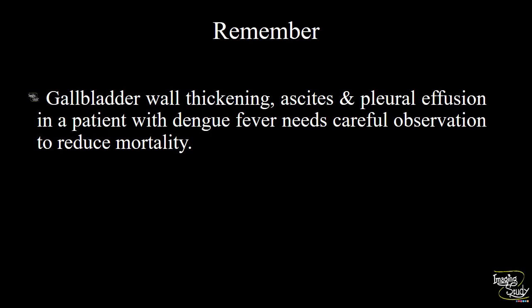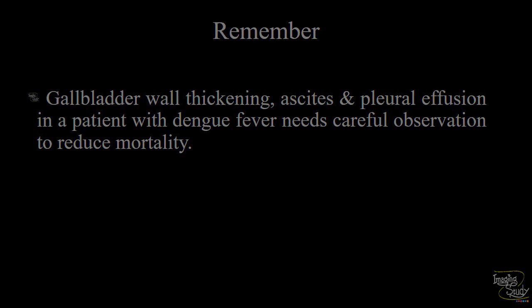The take-home message for this case: if you see gallbladder wall thickening, ascites, and pleural effusion in a patient with dengue fever, careful observation is required. We usually want to keep this patient in a center with an intensive care unit facility, because the patient may deteriorate at any time due to hemorrhagic complications or very low platelet count. Search for these features to reduce mortality in dengue fever cases.